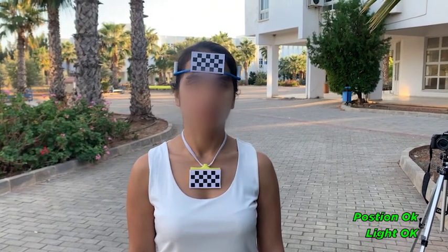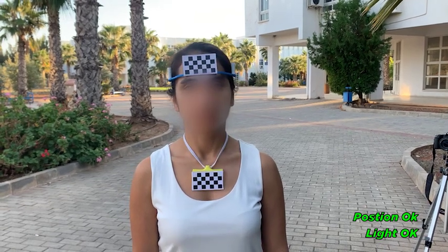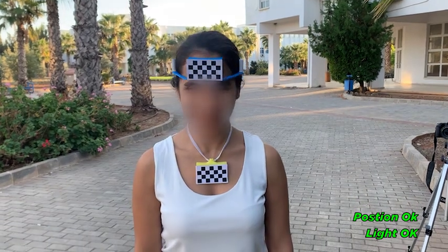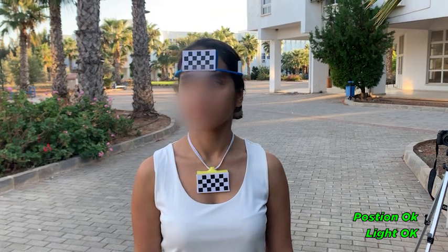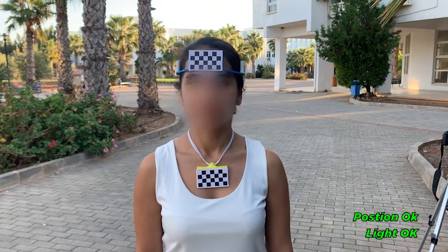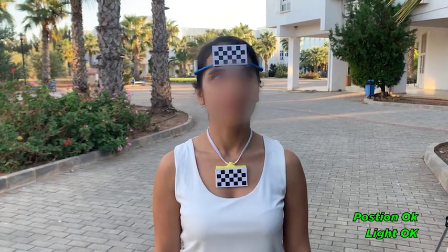Thanks to using two markers, movements get measured relatively. Hence, any unwanted factors such as the handshake of the camera person or unwanted effect of the patient's trunk movement on the measurement of the neck are removed. After the recording step, the video gets uploaded into the cloud for further processing.